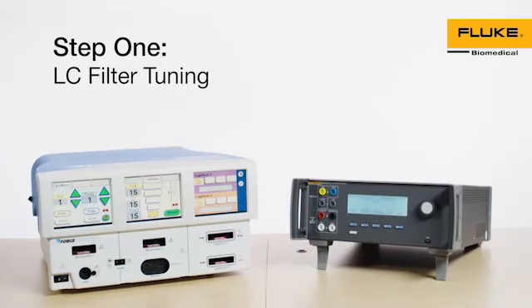Step 1: LC Filter Tuning. LC Filter Tuning is rarely required. When necessary, these are the steps when using the QAES-3.